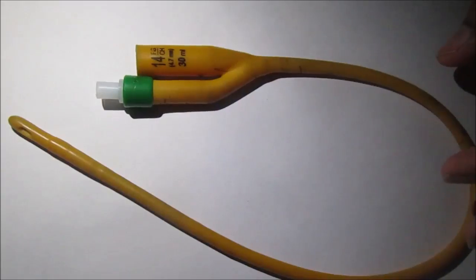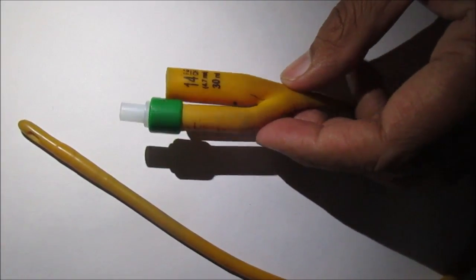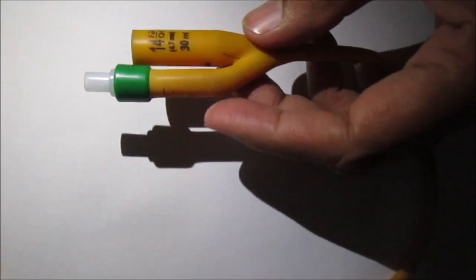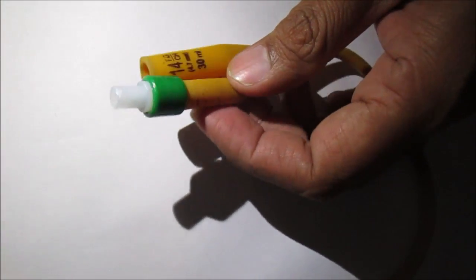There are many ways to treat the retained catheter. Before going invasive, the first one is that you cut the valve.